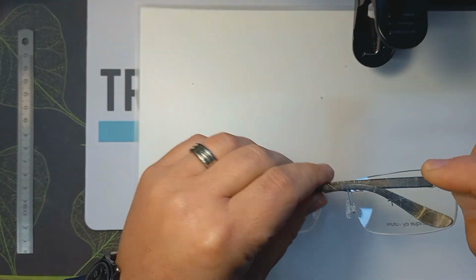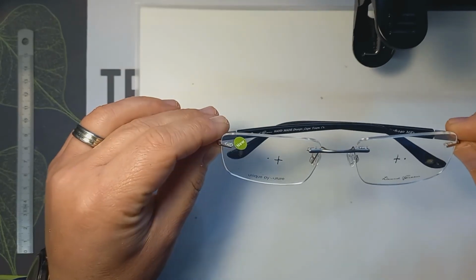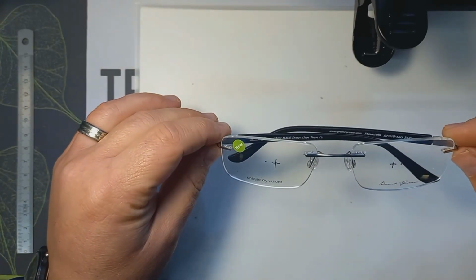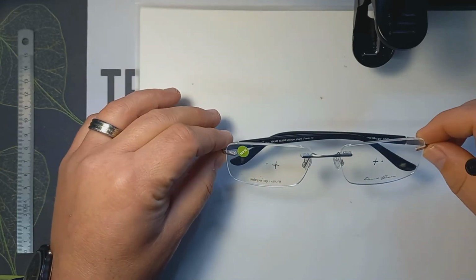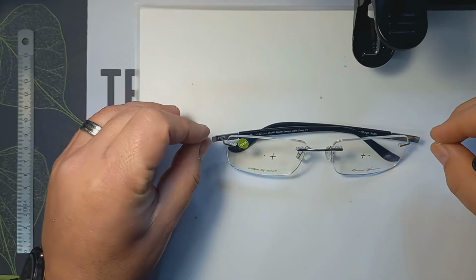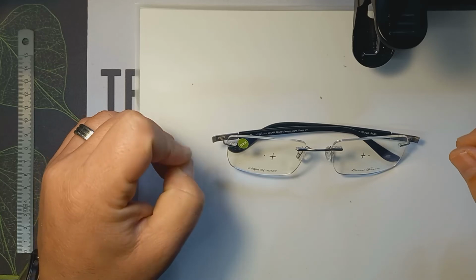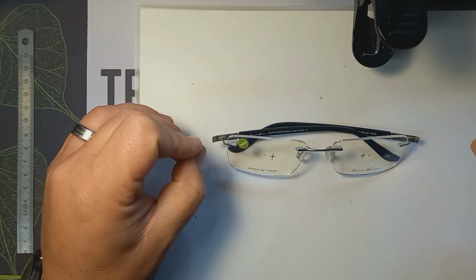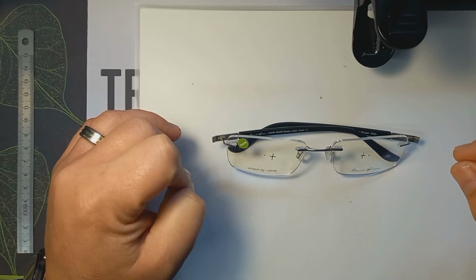But for today, I would just like to make sure that you understand how to use your markup chart to accurately pin down those coordinates on your frame, to have a good visual reference so that the next steps will make sense, and so that when you order lenses from your supplier, you know why these measurements are so important.